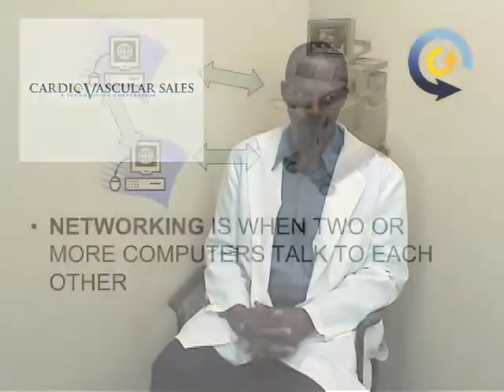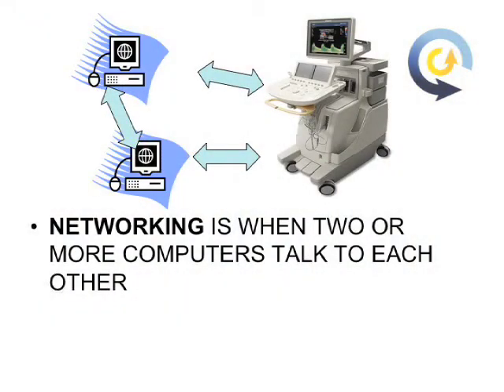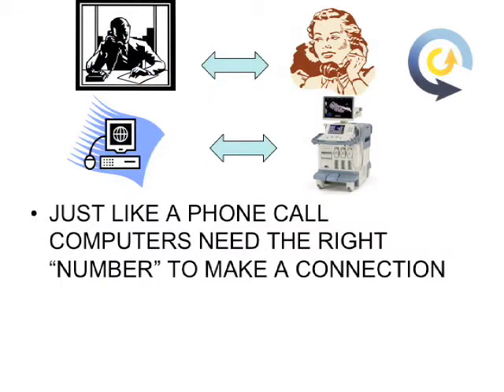in preparation. Networking is just two or more computers or ultrasound machines talking to each other. And as with making a phone call, you have to dial the right number, ask for the person you want to talk to, wait for a response to be sure that you're talking to the right person, providing the right information before you begin a conversation.